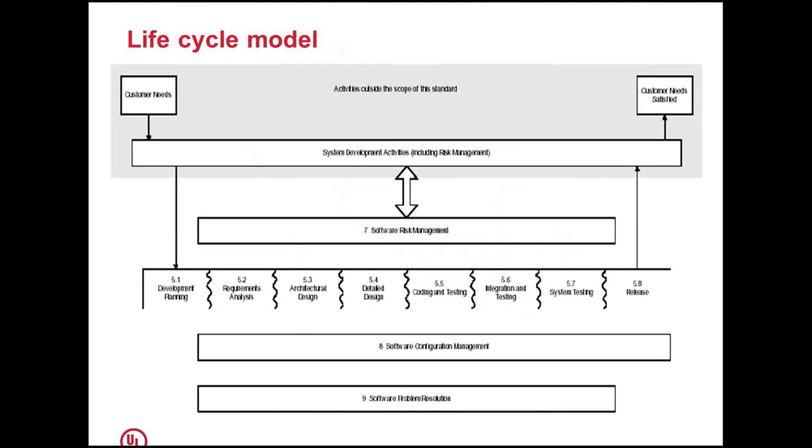And this is one life cycle model the standard is prescribing. It starts from the customer need. The customer could be an external customer or your own internal customer. Then the process starts. The first thing is the system development activities, which include risk management. Then there is a subset of risk management. And the development activities are further broken down into various activities and tasks.